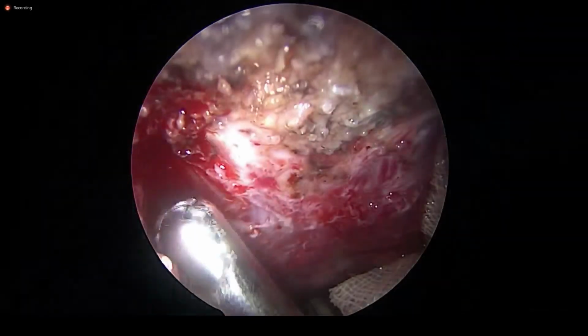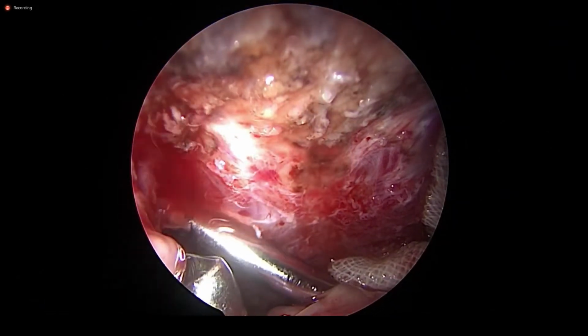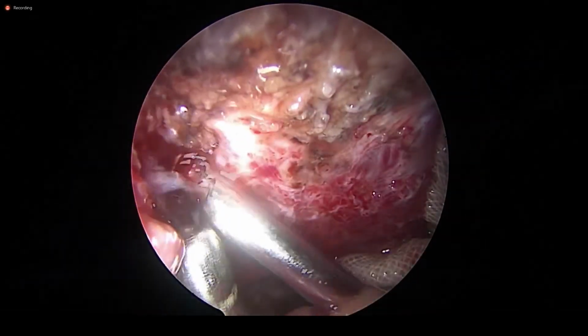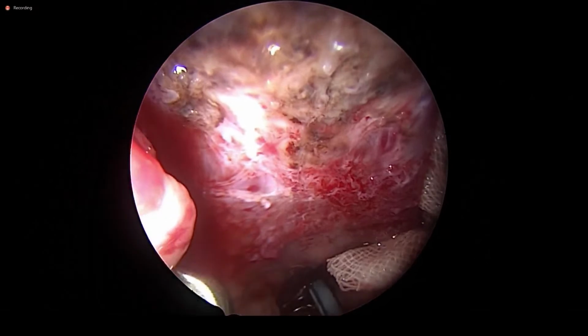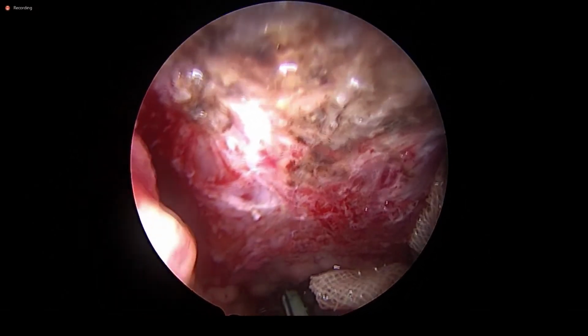See, the fossa of Rosenmuller is pretty clear now. So we have not gone anywhere laterally, beyond the muscles, to keep it very, very safe. Very safe. It is a very difficult area.